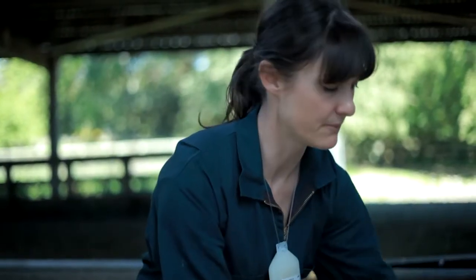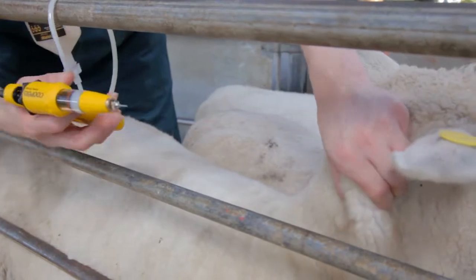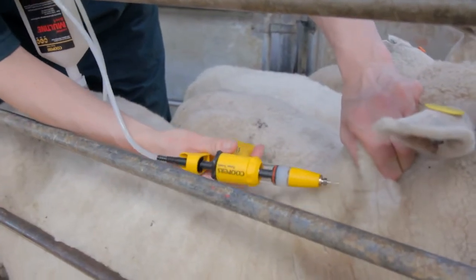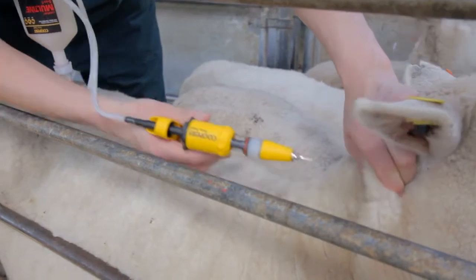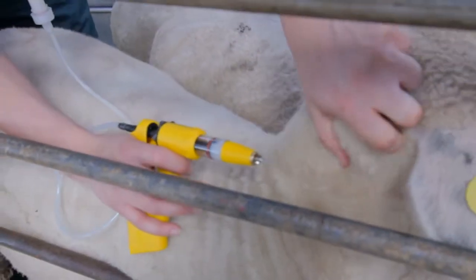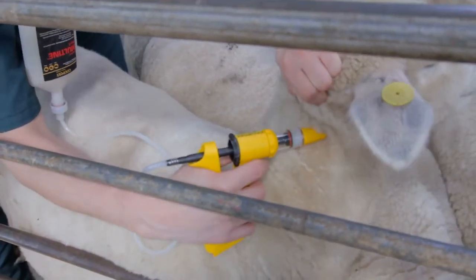To ensure the needle does not penetrate the underlying muscle, use your finger and thumb to form a skin tent. This is the area that you vaccinate into. Gently push the needle through the skin and depress the plunger. This should be relatively easy to do.